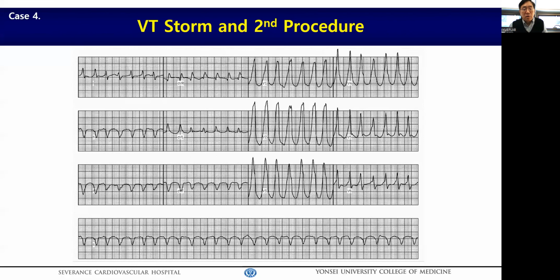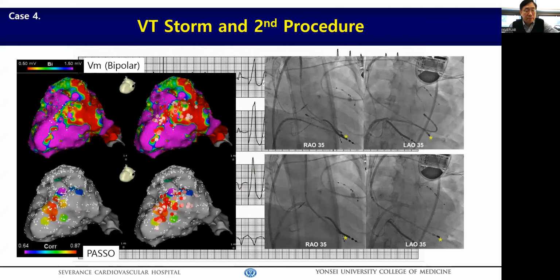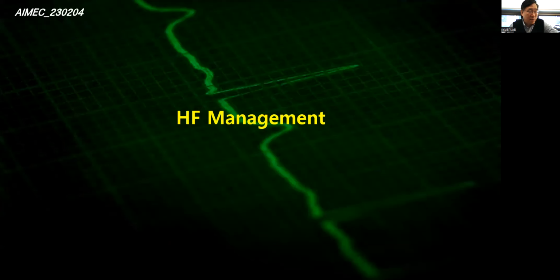Unfortunately, our patient came back to emergency room because of VT storm a few months after the procedure. At this time, VT morphology apparently differs from the previous ablation. It is superior axis compared to the inferior axis before. We found VT originated from mid to basal posterior septum and conducted scar dechanneling here. This time, we used IV sedation during intubation status. After the disappearance of VT, we conducted a pacemap-guided procedure to exclude the risk of VT suppression again by anesthesia. Currently, he's okay without ICD therapy.